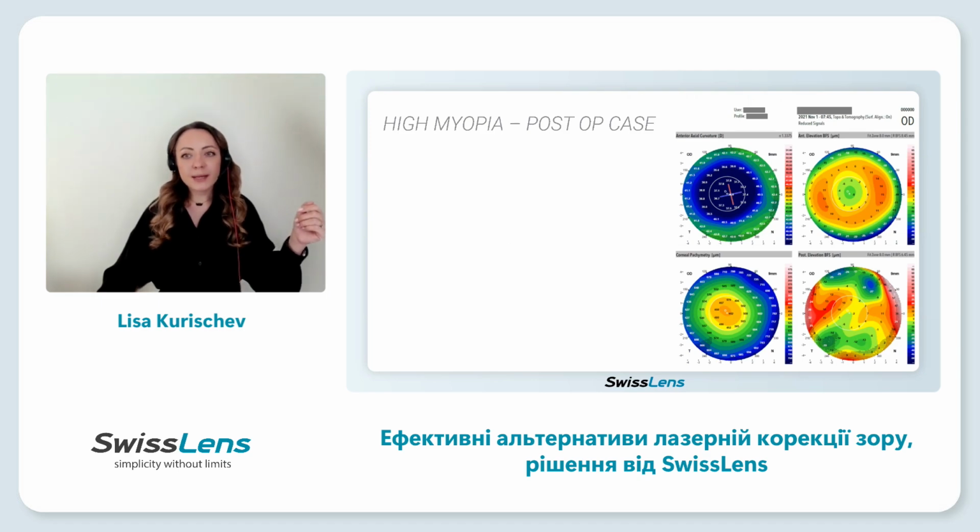So how to calculate the lens with this kind of topography? Actually, it's very easy. You just need to follow some rules and use our website. So let me explain you. First step is to find the flattest radius on the ablation zone. Here, you can see it.